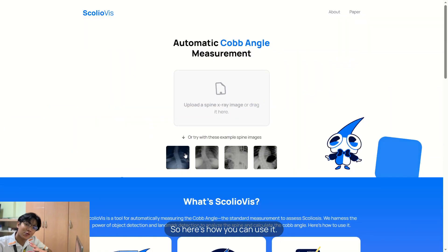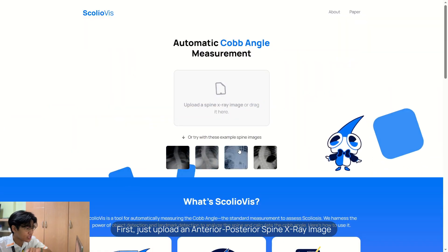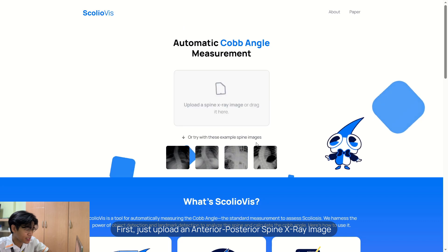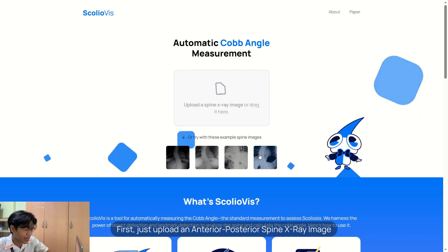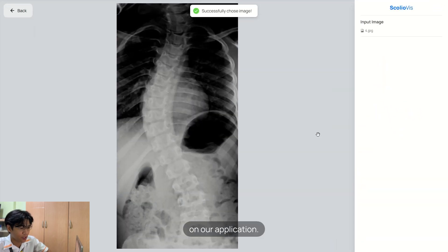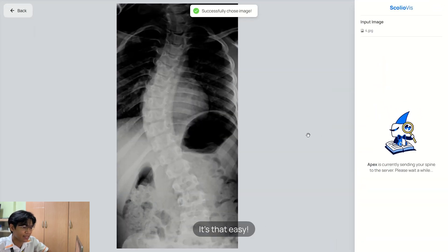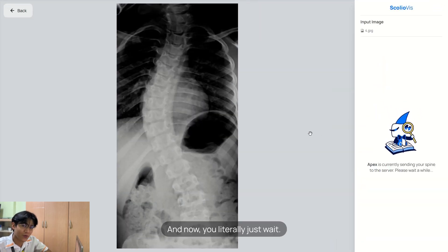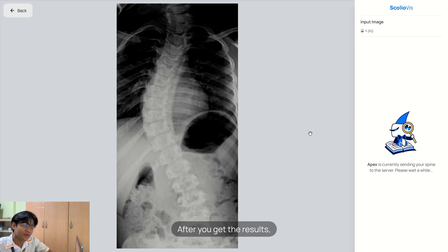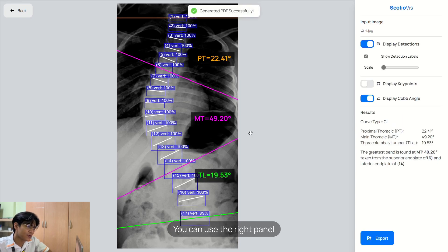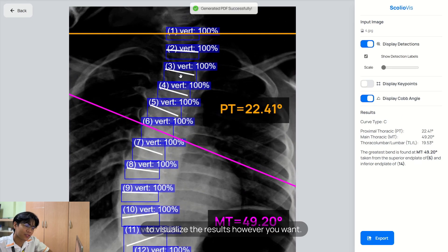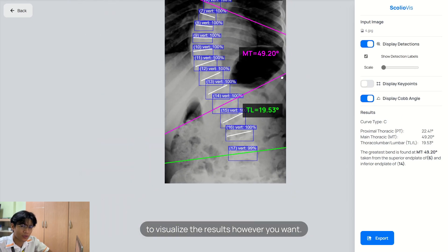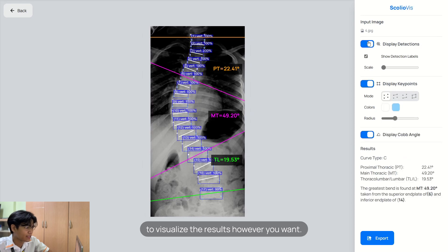Here's how you can use it. First, just upload an anterior-posterior spine x-ray image on our application — it's that easy. You'll literally just wait, and after you get the results, you can use the right panel to visualize the results however you want.